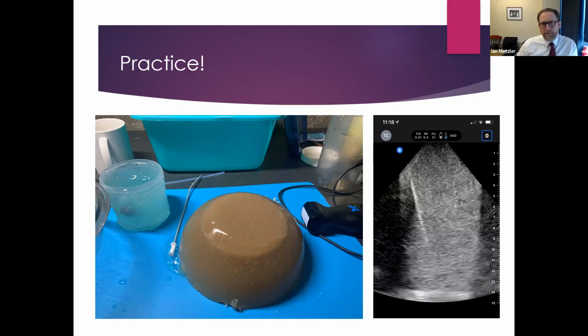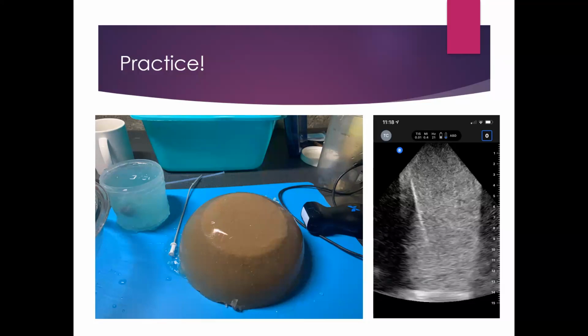Yeah, and so tell me about how you place nephrostomy tubes, because that's 90% of the battle in terms of getting access. Yeah, most of the time we use the flank position and we support the kidney, and then we follow the posterior axillary line, just before and below the 12th rib, with ultrasound guidance, as you have shown us on the imaging. You use an almost 90 degree needle prick on the kidney.